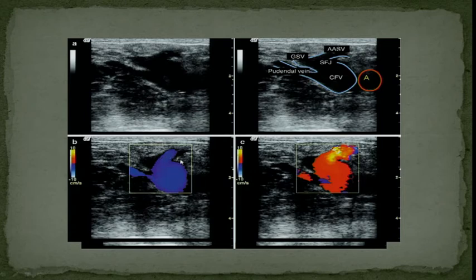Is this color scheme normal? Are apples growing on top and ocean on the bottom? Is that correct? The color scheme is right. So the tech's mechanics, or knobology, is all right. Why is this wrong? Is it wrong? And if you said yes, why?